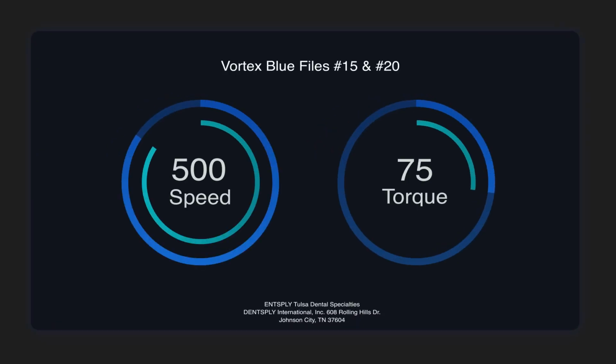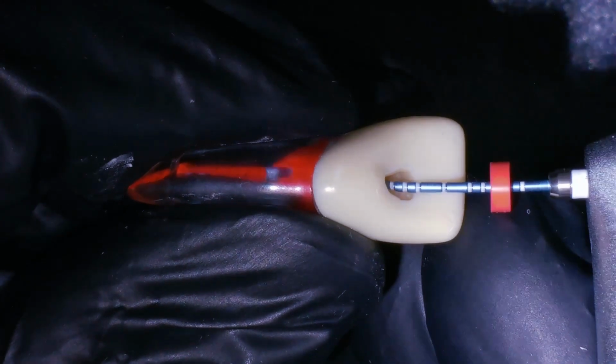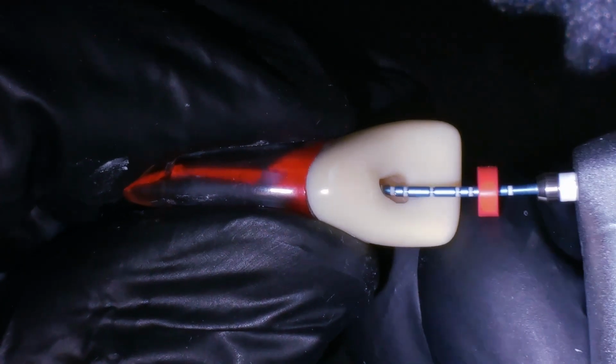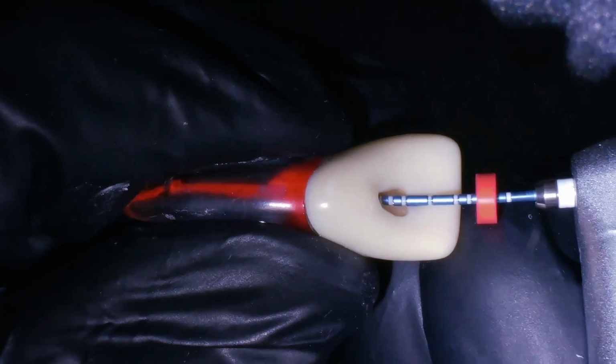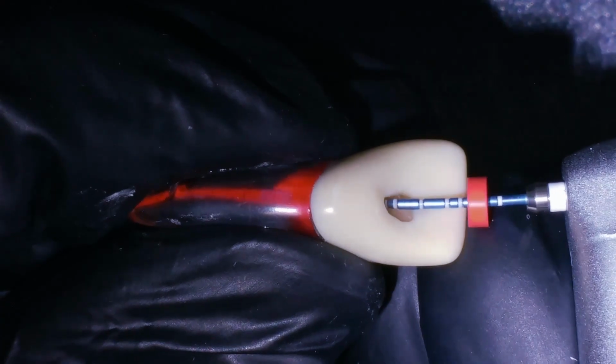Note that each rotary file has its own recommended speed and torque that should be respected to avoid instrument failure. Insert the rotary file until slight resistance is felt without turning it on, then press the button to start it. This is called tactile controlled activation technique. This allows tactile sensation to the clinician, minimizes file engagement and failure of the file, and keeps the file centralized in the canal to avoid transportation.